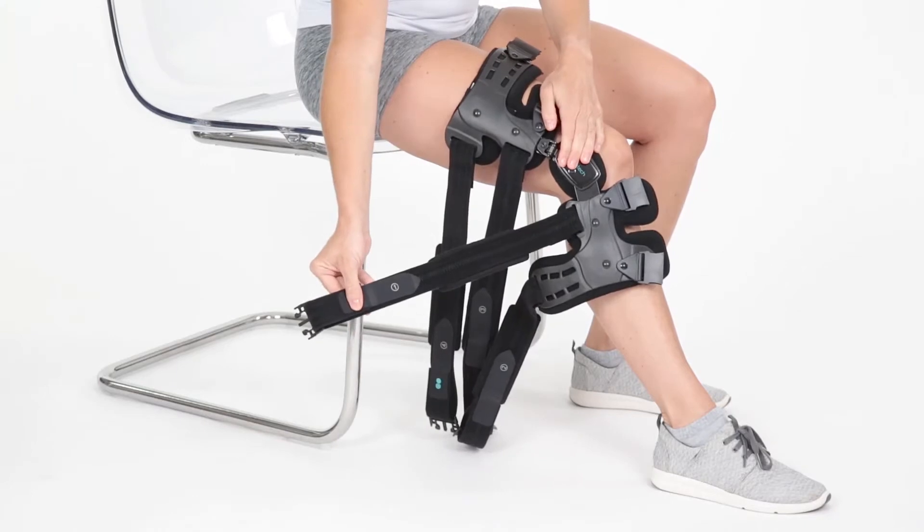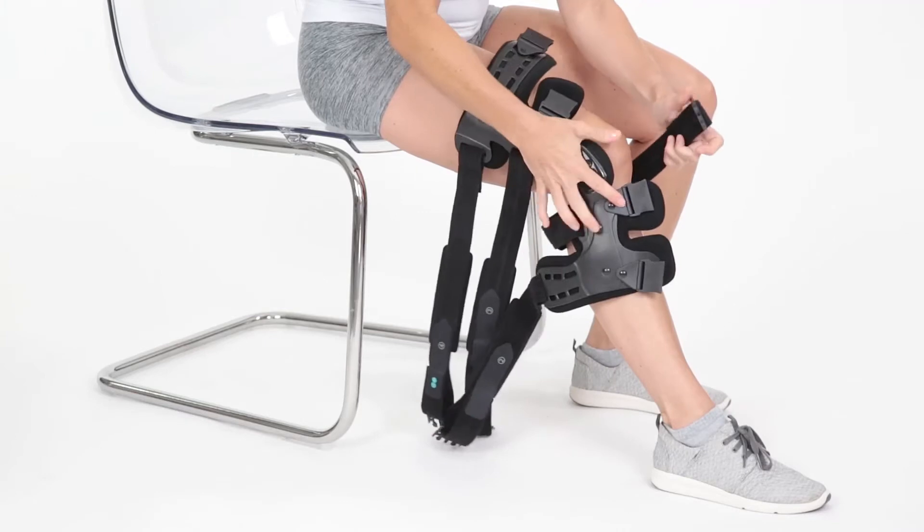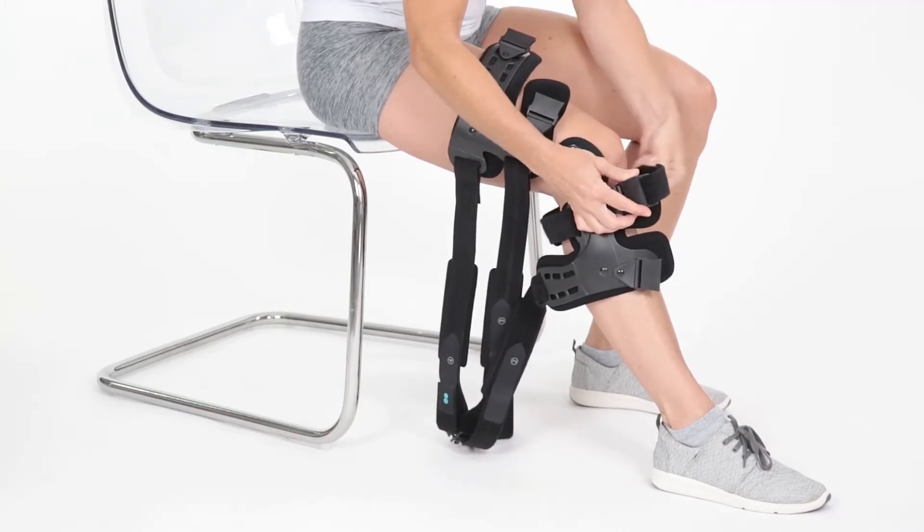Fasten the strap labeled 1 directly under your kneecap, followed by straps labeled 2, 3, and 4. Make sure the hinge remains aligned with the kneecap while securing the straps.